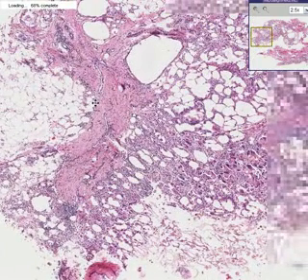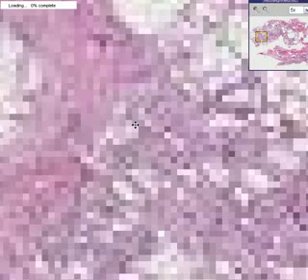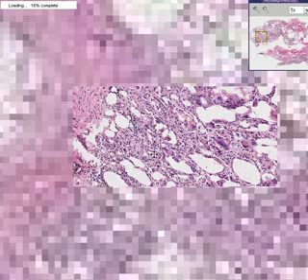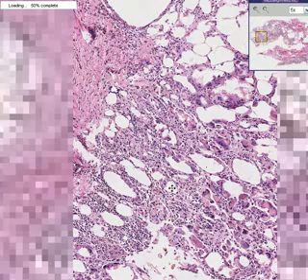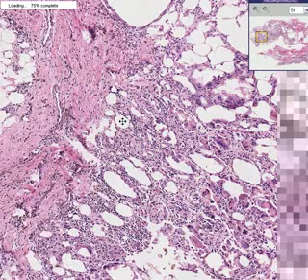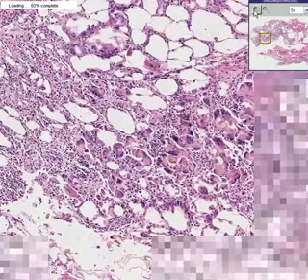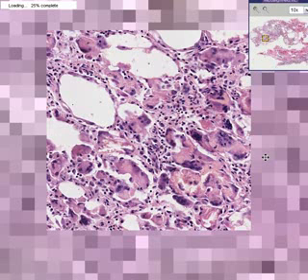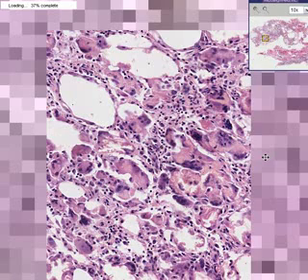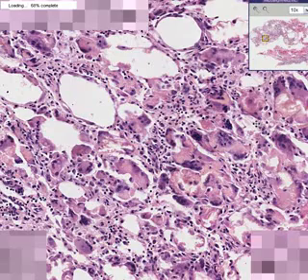this fat which generally look like inflammatory changes, and they're characterized by three things. First, you could see general inflammatory cell infiltrates within the fat. Secondly, you see an abundance of giant cells, the typical multinucleate giant cells, very much looking like foreign body granuloma cells, because that's exactly what they are.